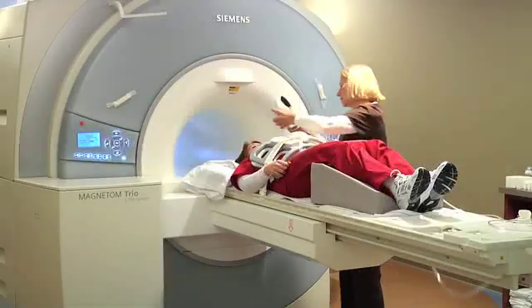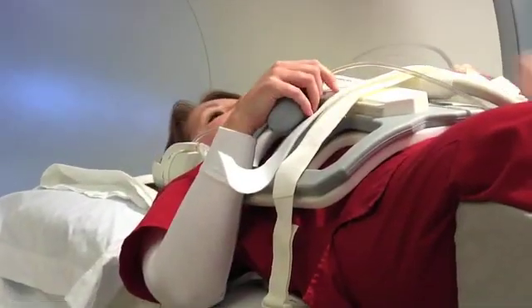MRIs are noisy, so we're going to be giving you some hearing protection in the form of headphones. We'll let you listen to your favorite radio station.